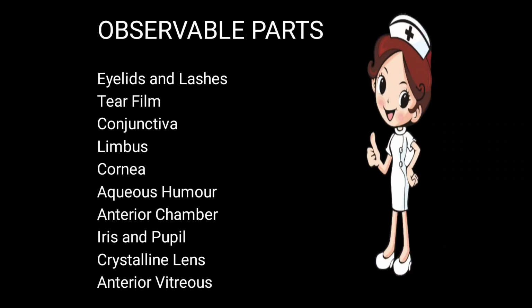Observable parts. Which parts can we observe? Eyelids and the eyelashes. Tear film. Tear film is present on the cornea. Next one is the conjunctiva. We can observe all the conjunctiva: palpebral conjunctiva, bulbar conjunctiva. Okay, next one is the limbus. The limbus is the junction between the cornea as well as the sclera.